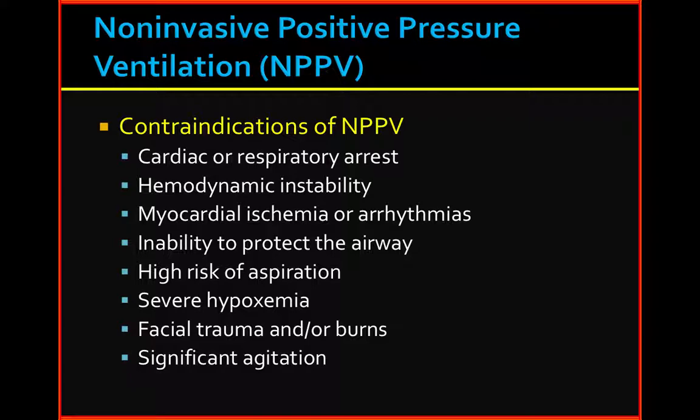So think about all of these different variabilities, and now you can quickly see how there are so many different ways that you can ventilate somebody, and each one of these ways is a different mode of ventilation. You may have heard of these before, like AC, or SIMV, or pressure support, or CPAP. These are all different modes, and we're going to go through some of these modes and show you how it makes sense about how this is working.